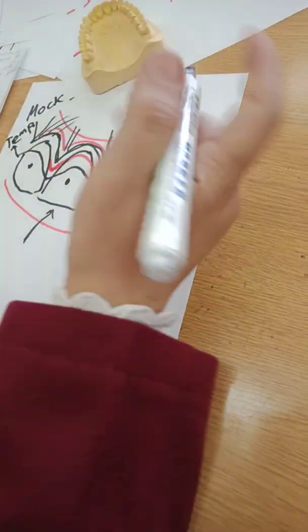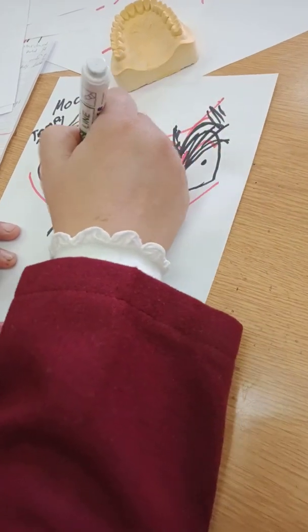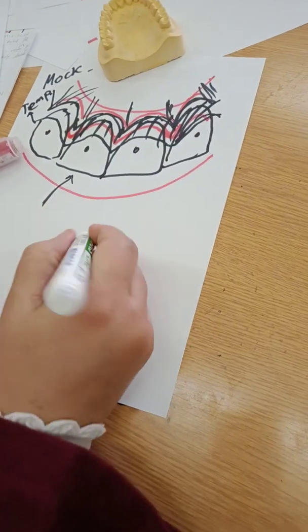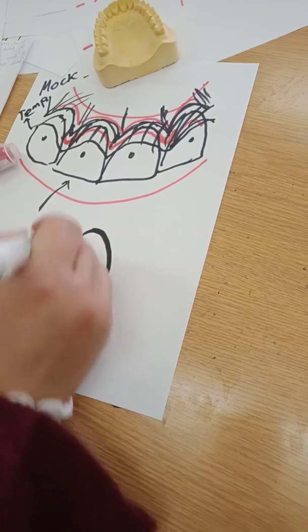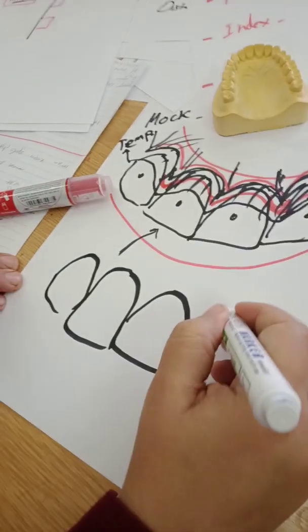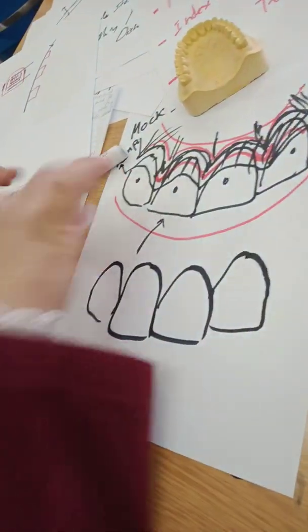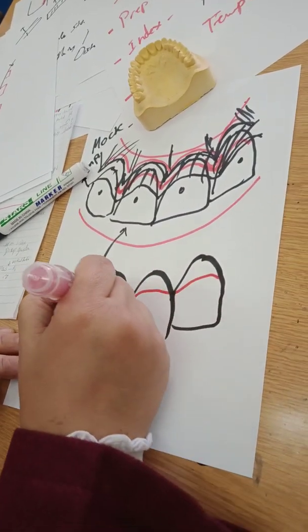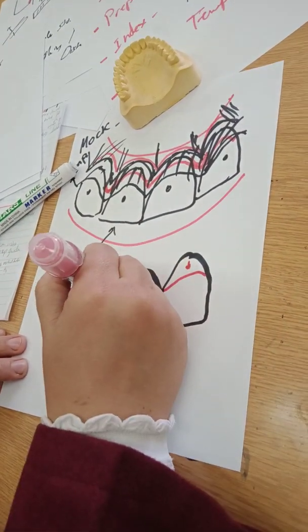I put it in the index, put it on the teeth. What happens is that the excess material will come out from here. So this is excess. What I'm going to do is cut it all off. The end result is what? These are the teeth. These are my laterals. The end result, we also have canines, but let's make it short. The end result is our temporary material is covering all of the veneers except what? This gingival part. Additive composite.